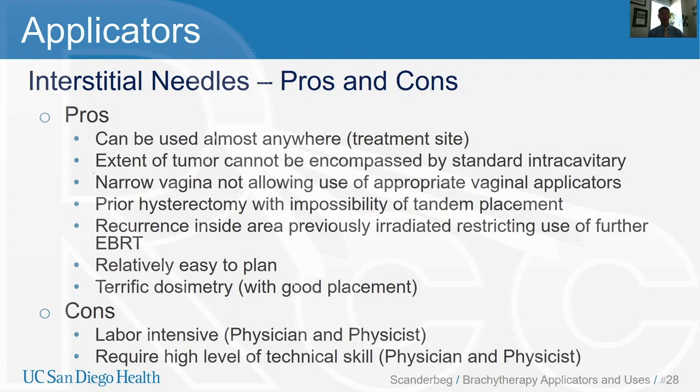A key disadvantage is that they're extremely labor intensive for both the physician and the physicist, and they require a high level of technical skill because of the nuances. Many physicians have not received a lot of training during residency in interstitial implants, especially here in the US. Putting needles into tissue requires a high level of competence, confidence and skill from the attending physician. The process can still be quite labor intensive. This is the same for physics, in order to correctly connect, measure, label, and digitize each of those needles.